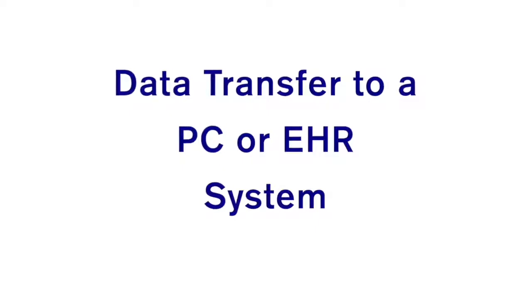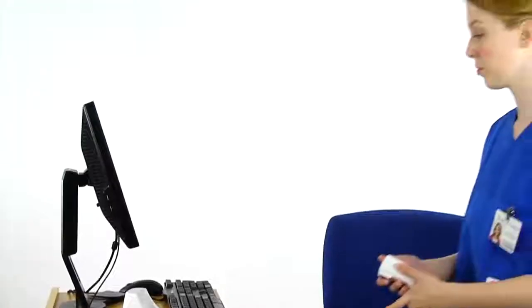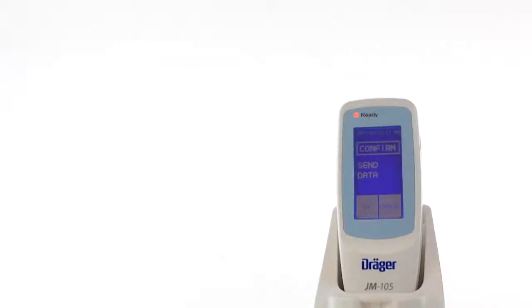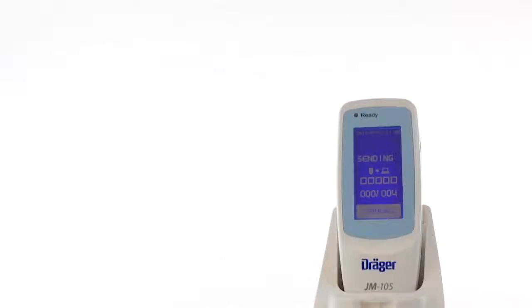If the device is in Link On mode and you wish to transfer measurements from the JM105 to a PC or EHR system, place the JM105 in the docking station. The screen will show Send Data and Confirm. If you want to send the stored data, press OK. The screen will then indicate that it is sending the data.